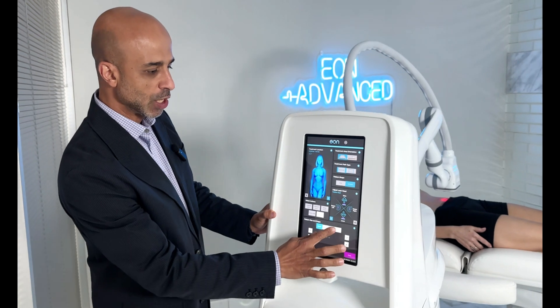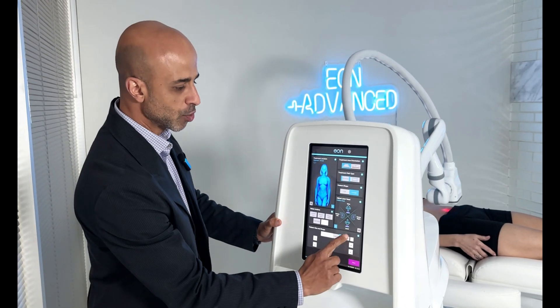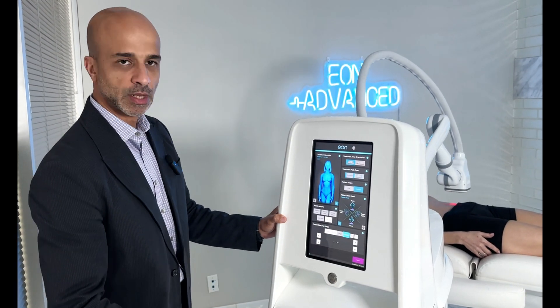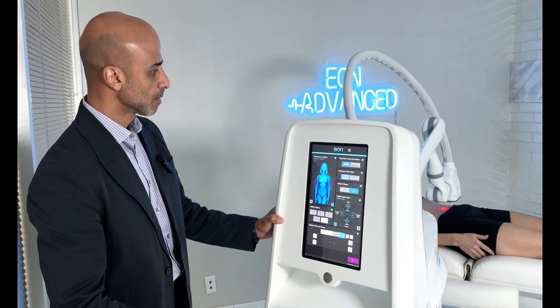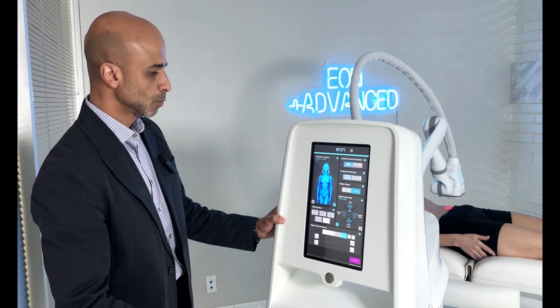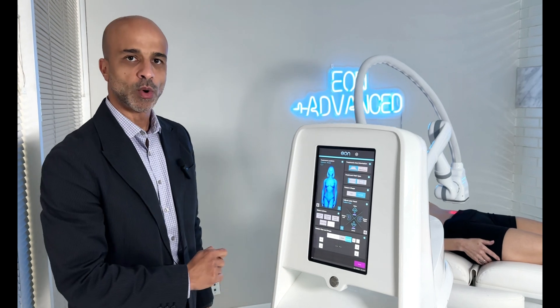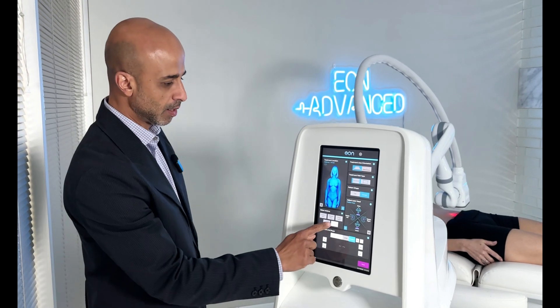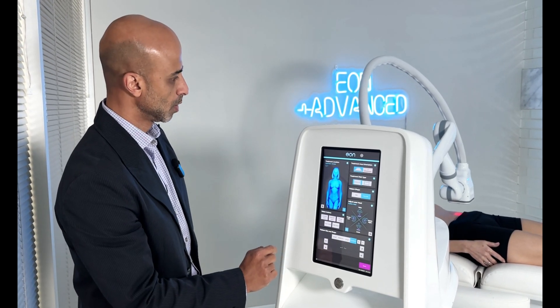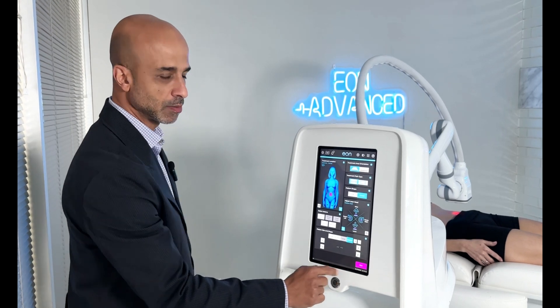Again, I can change the size to a custom size. I can incrementally increase the size by a little bit. And if this is exactly the way I want it, I can end the test. And now I can start the treatment.